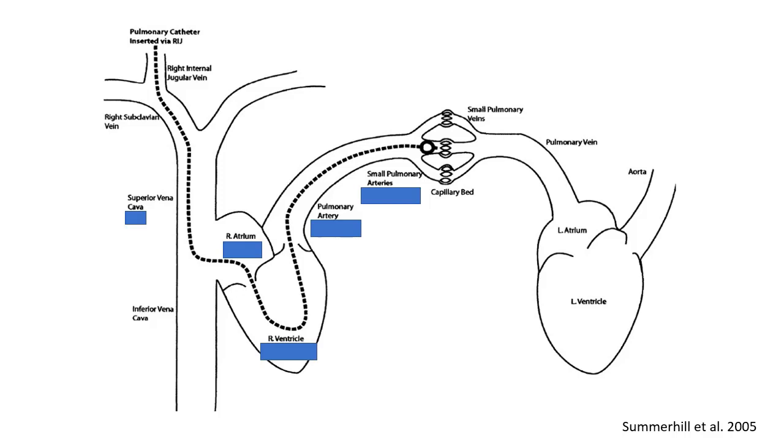So this one I steal from, I didn't hear it directly from him, but I've heard it from some of the fellows that Ed Gray teaches about this, and I think it's a great analogy, which is in the superior vena cava, the high normal pressure is going to be a nickel, 5.